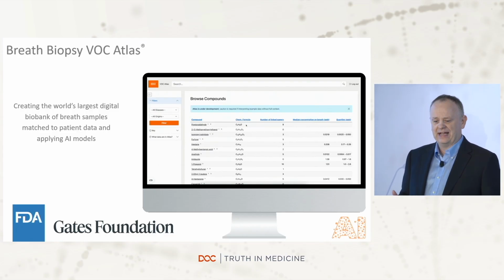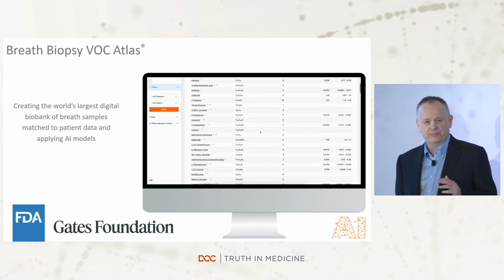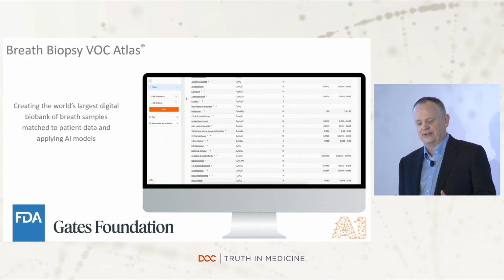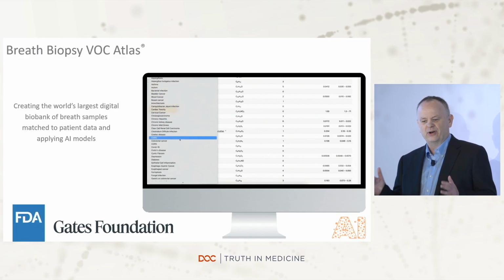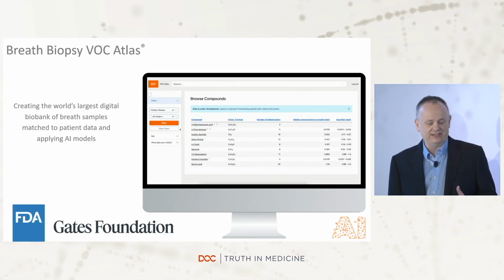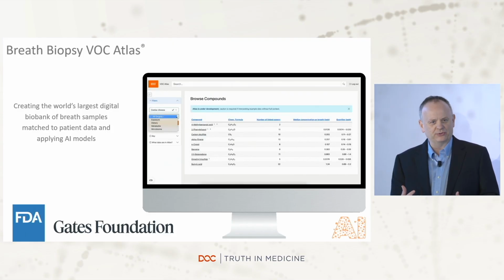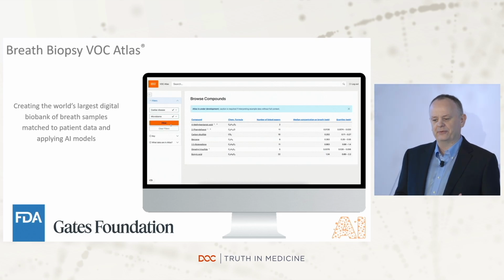One thing Owlstone has been doing is building up an atlas of all these chemicals. With the support of one of our investors, the Gates Foundation, we built an interactive sample biobank that links all those different chemicals in breath to the patient data that's there, where we can apply models to understand what's happening.